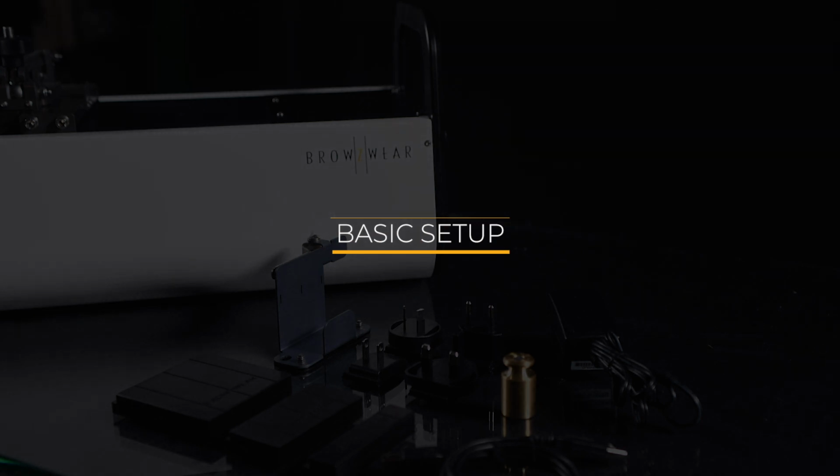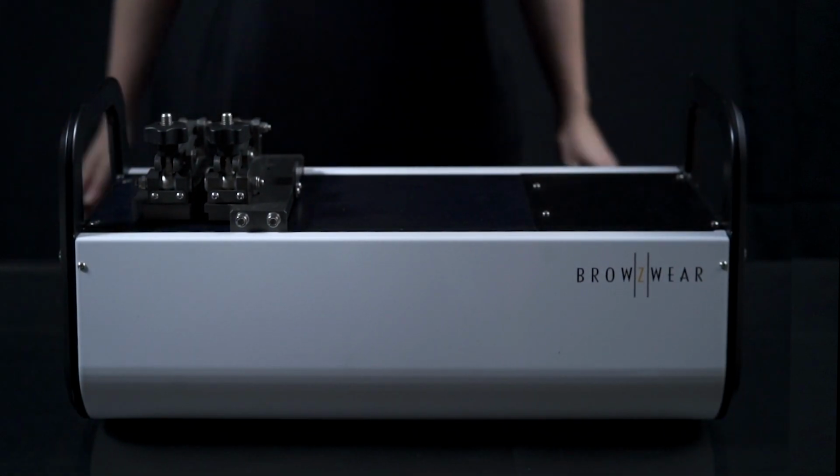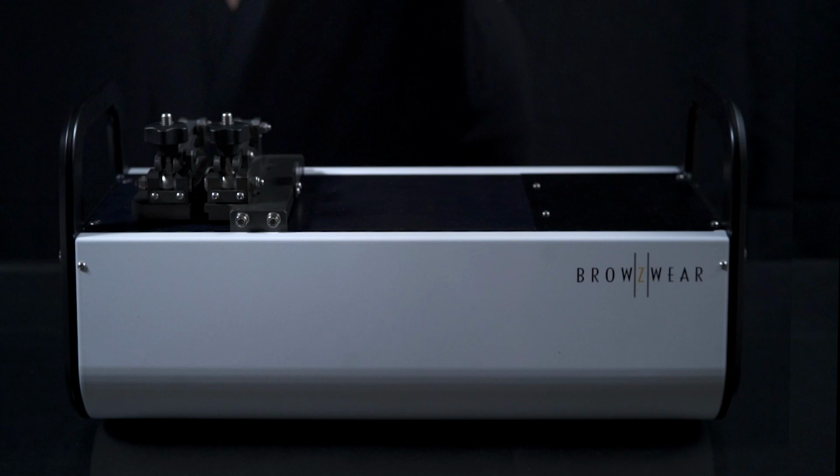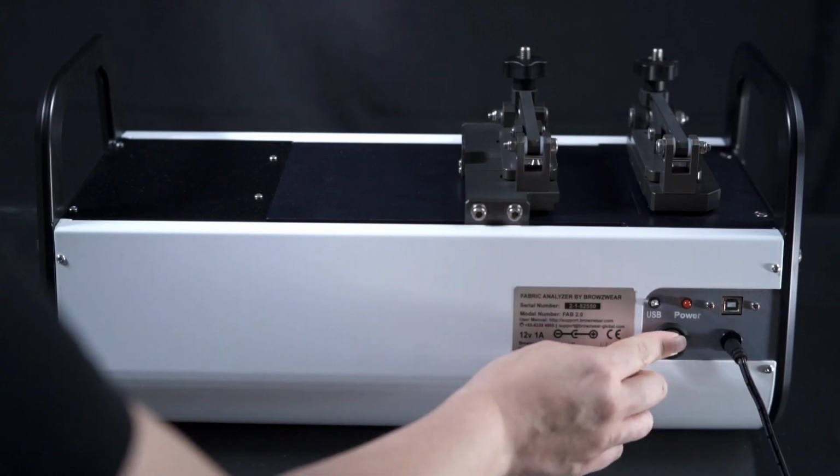You're ready to begin setting up your FAB machine. Ensure your FAB is positioned on a flat, stable surface so the testing sensors do not pick up extraneous movements from the surrounding environments and potentially corrupt your data. Connect the FAB power cable. Run the cable from the FAB power outlet to the wall power outlet and turn it on.